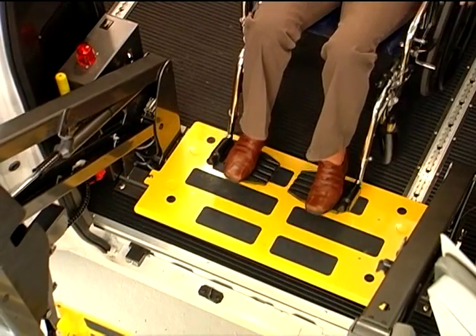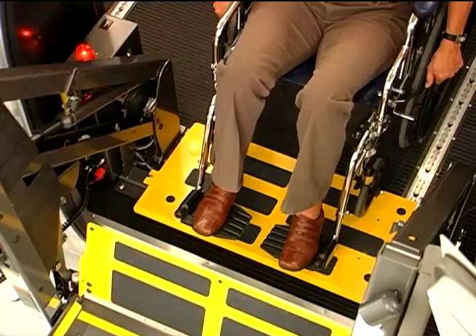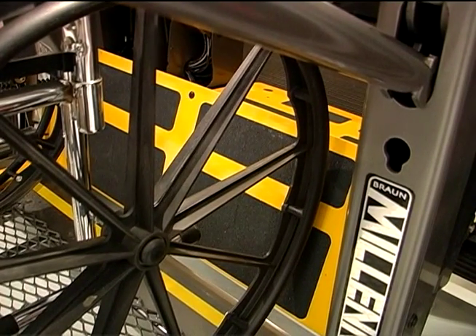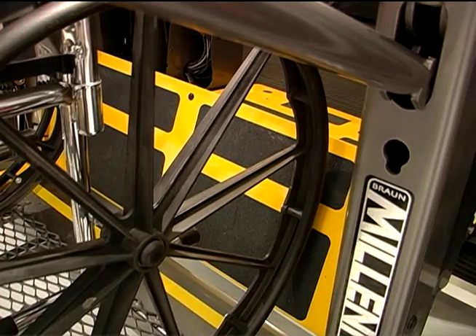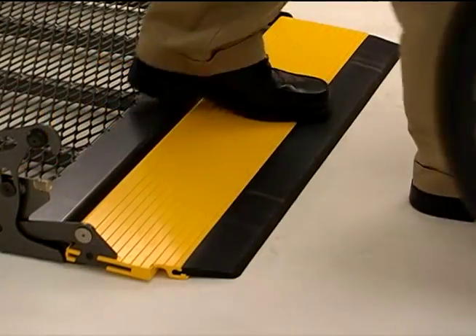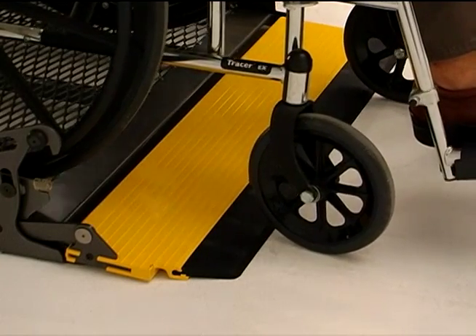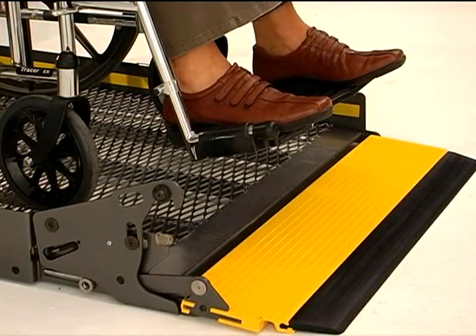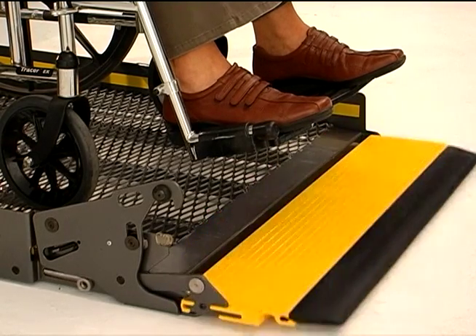The threshold warning will also sound if a passenger enters the threshold area while the platform is in motion. Movement of the platform will be prevented by the interlock system if the inner barrier is occupied or doesn't transition to its fully upright position. Similarly, when the platform is at ground level, the outer barrier forms a bridge between the ground and the platform, and upward movement of the lift will be prevented by the interlock system until the outer barrier is fully upright.